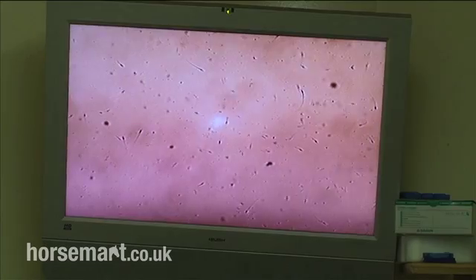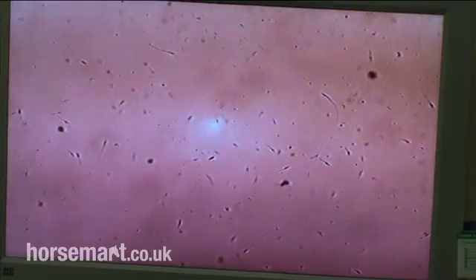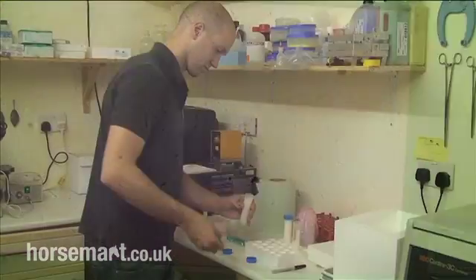There's one slightly to the left and low of center that's definitely in trouble — it's going around in very, very small circles. Jamie will point to some sperm that are not progressively motile. He can also point out one that's got good progressive motility — going in a nice straight line. It's trickier to catch those guys than the ones going in circles.